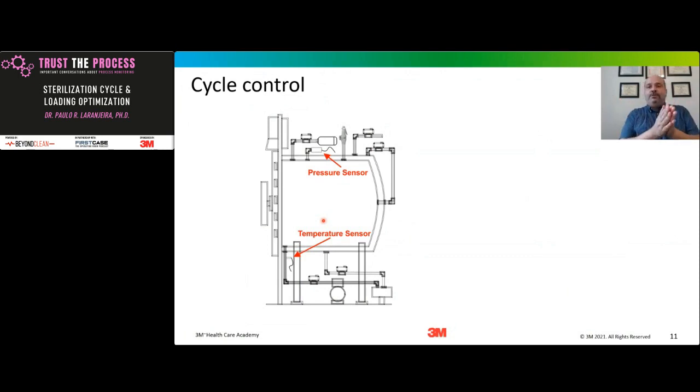Also keep in mind that the manufacturer of the sterilizer, when they develop the cycle, also uses simulated weight to determine the mass and how the cycle can be controlled by the equipment, but they do not use your real load. So even the sterilizer manufacturer does not test their equipment with all the cycle configurations that we see in the market. So we need to prepare ourselves and also learn from our process how to better use the equipment.